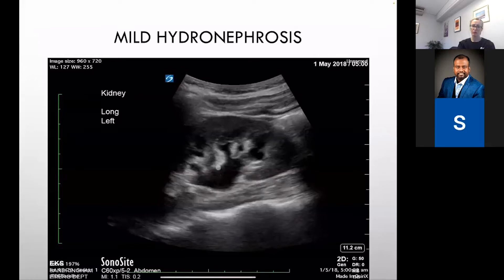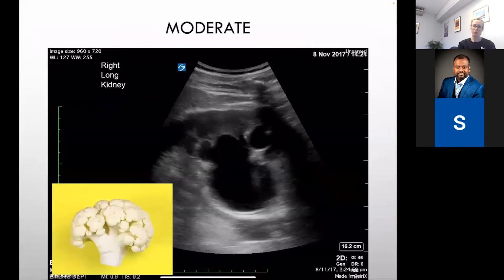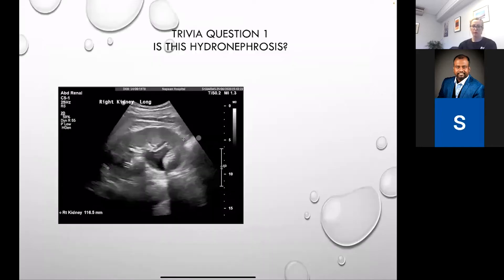Mild hydronephrosis: major system dilated, minor dilated, but the cup still retains its shape and there's a reasonable cortical thickness. Moderate: major dilated, minor dilated, and it's starting to flip the other way — almost like a cauliflower structure. Severe: everything is quite ballooned with thinning of the cortex.